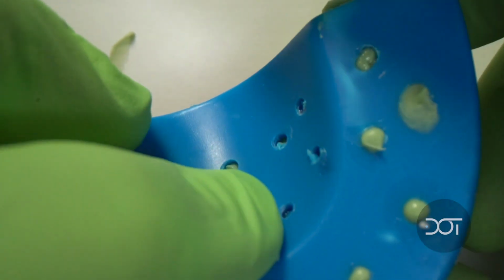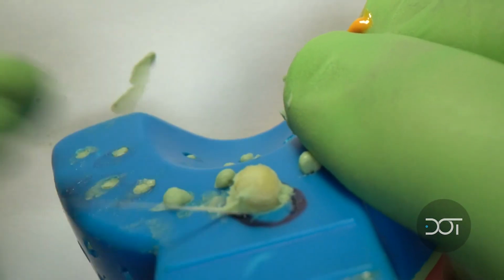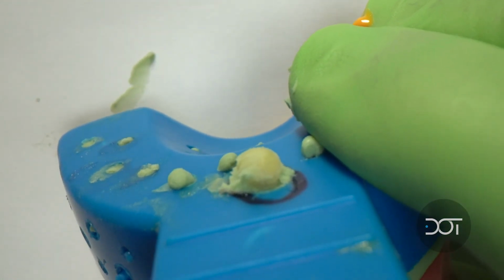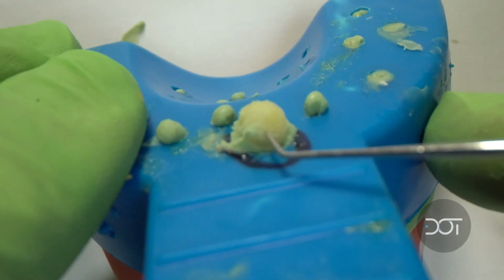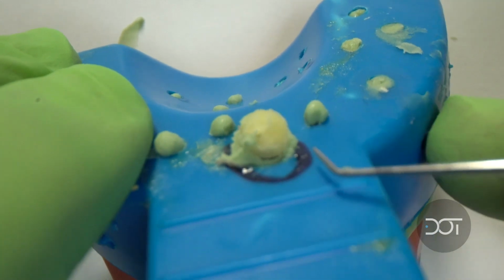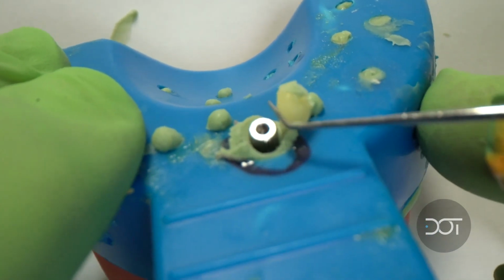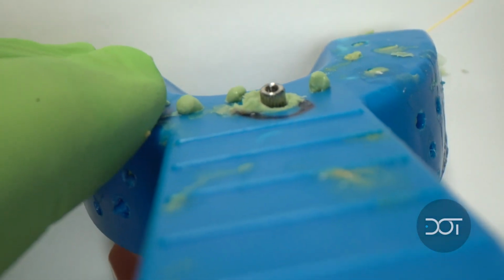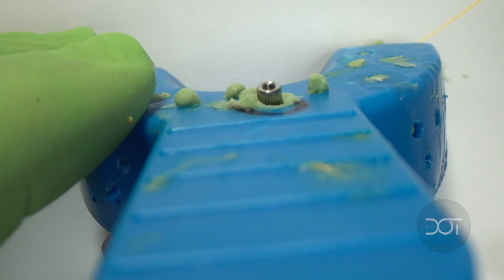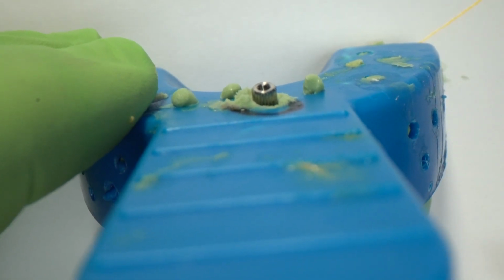I'm going to be looking for that ball to come through that surface. And I can see that ball of material as it's coming through. And I can use an explorer, and I will just poke my explorer into that flowable composite. And I have a nice clean thread there, a nice clean screw for my driver to go in to be able to remove that after the impression material is set up.